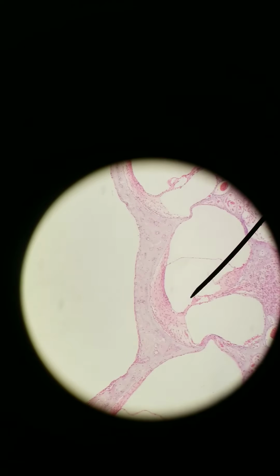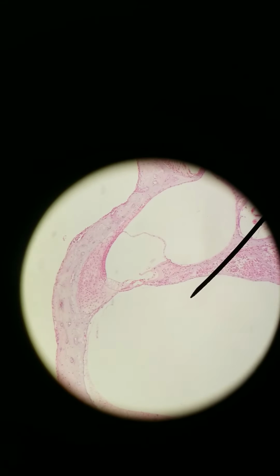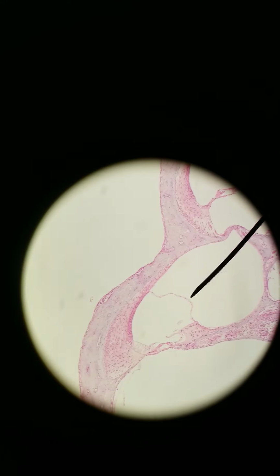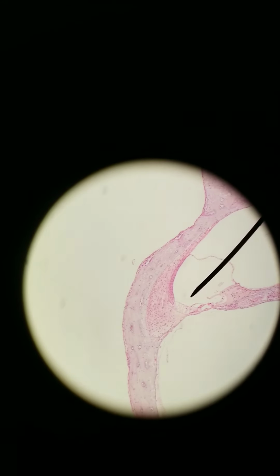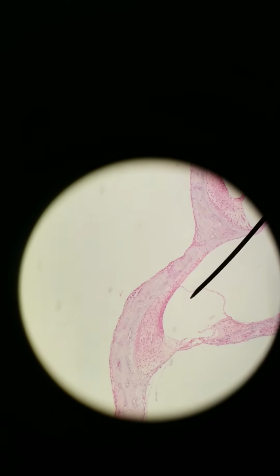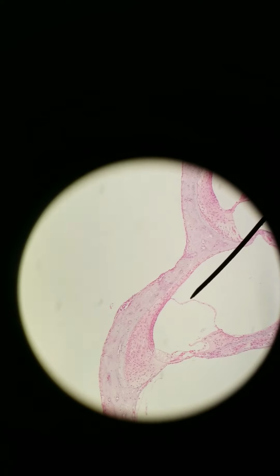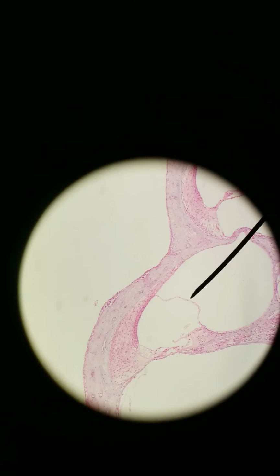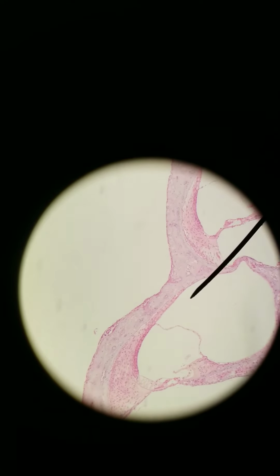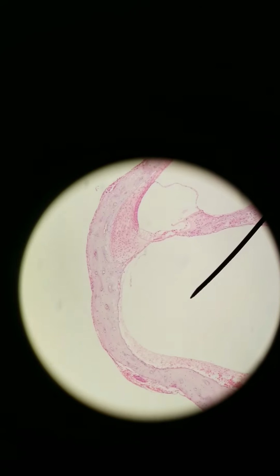How do I know which one's which? Like, how do I know it's not flipped? Let's stick with this one. Look for this: when you have the division between media and the others, media should be easier to recognize. On one side of media, you've got a thin border, right here, and on the other side, a very thick border. The diagonal thin border is called the vestibular membrane, and it separates scala vestibuli from media. So this is vestibuli, this is media, this is tympani.